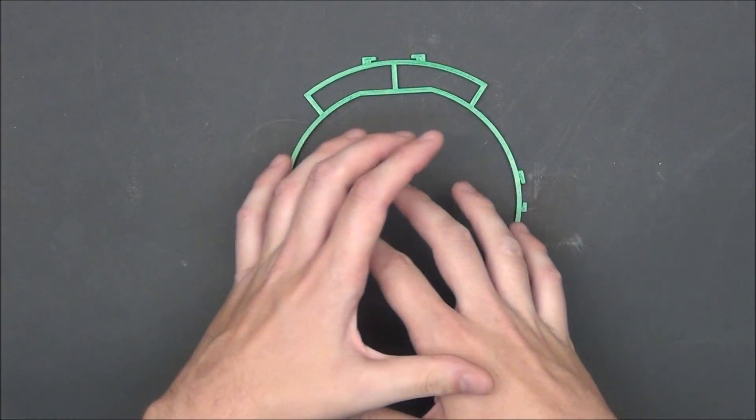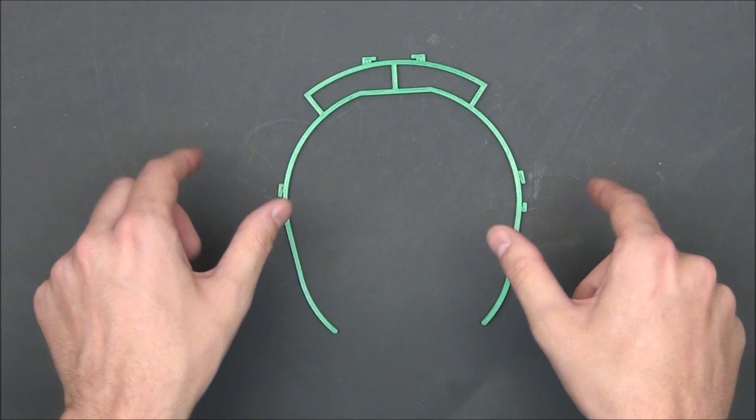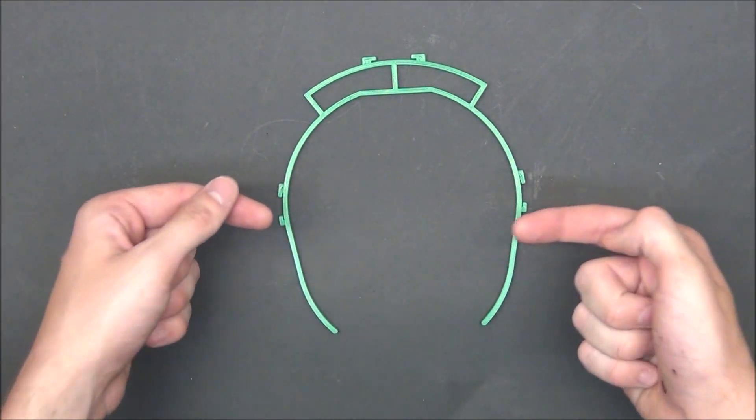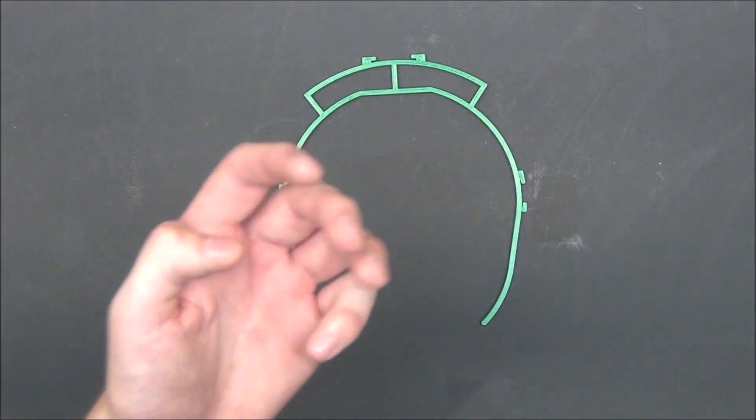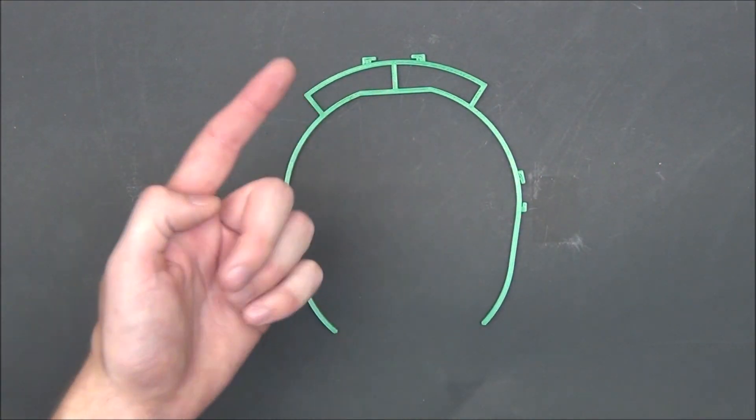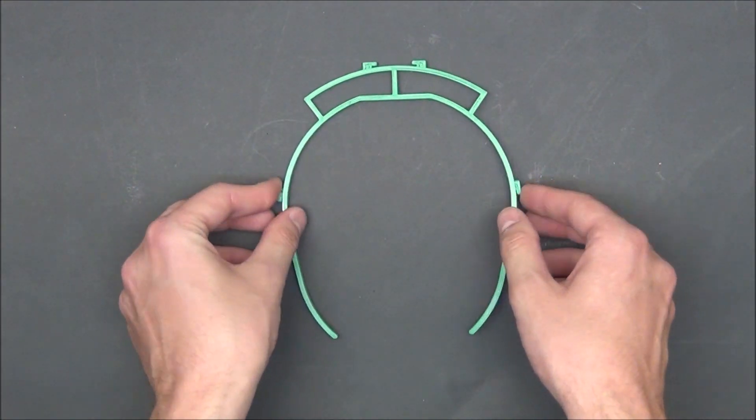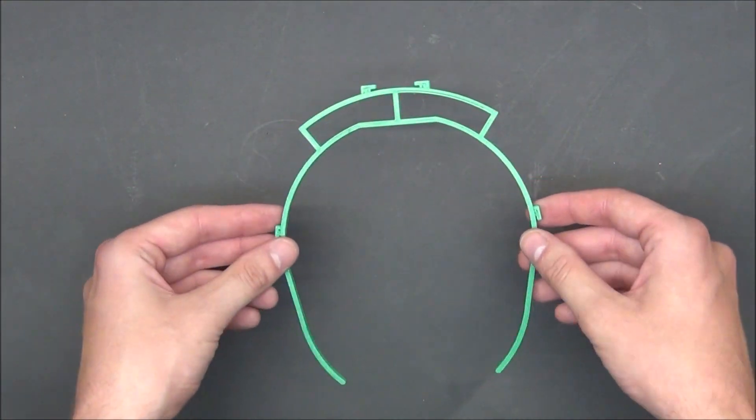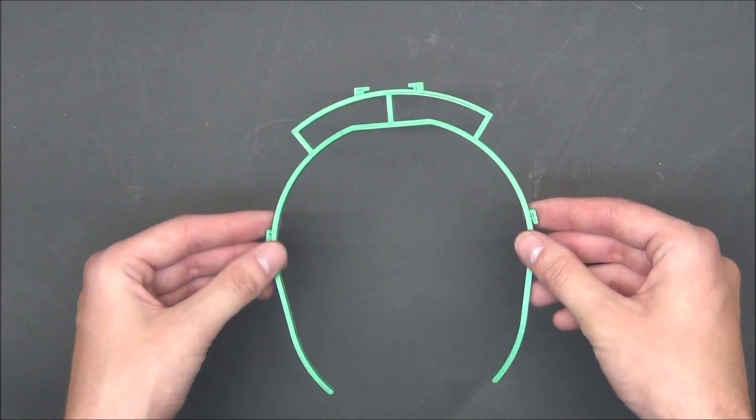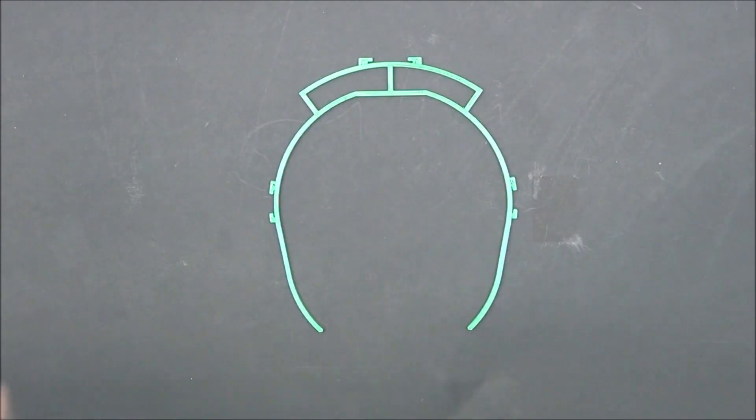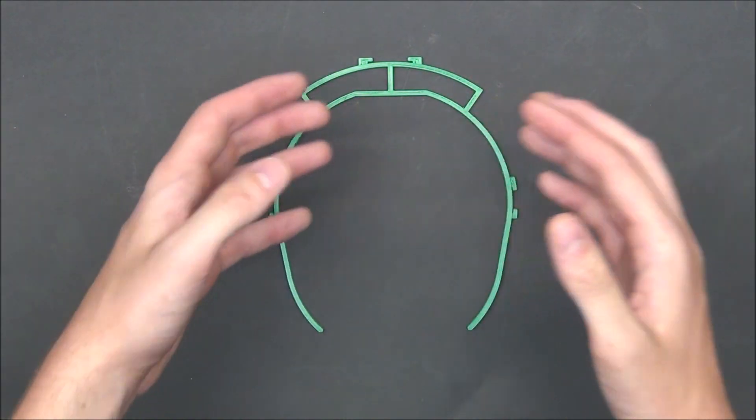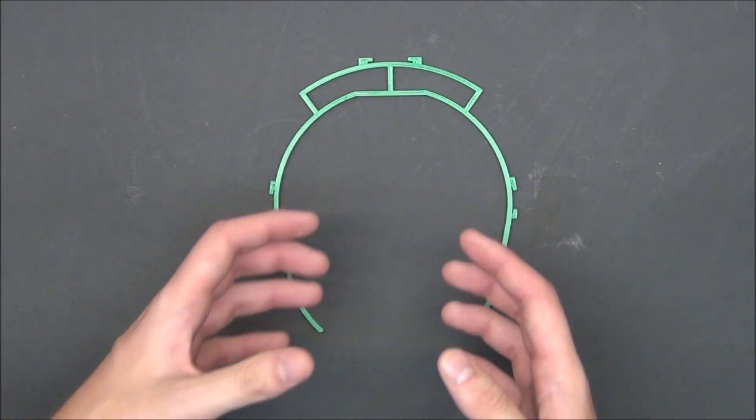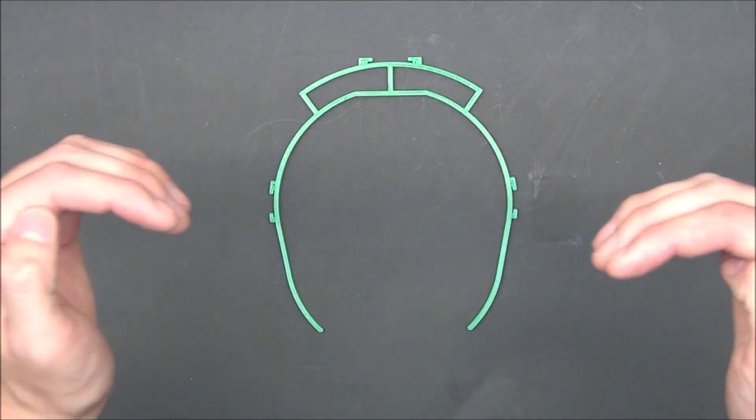When designing this, I tried to make everything as thin and short as possible for three main reasons. First off, you of course want to be lightweight so it's not annoying to have on your head. Second, as we mentioned earlier, you want to be able to print as quickly as possible.